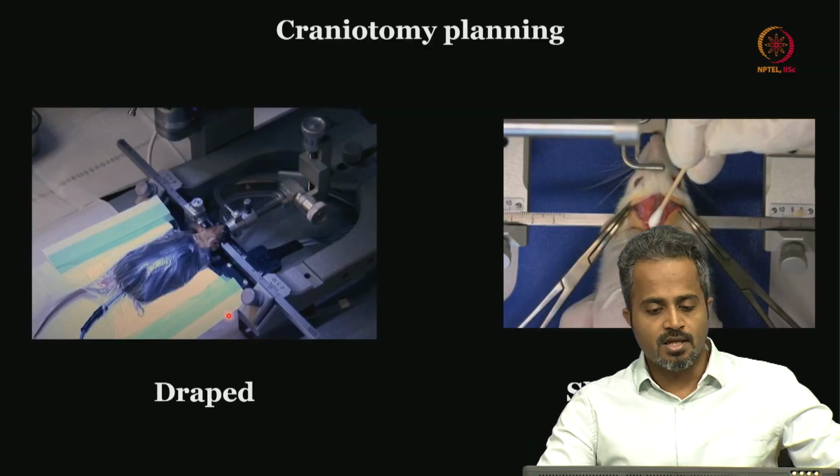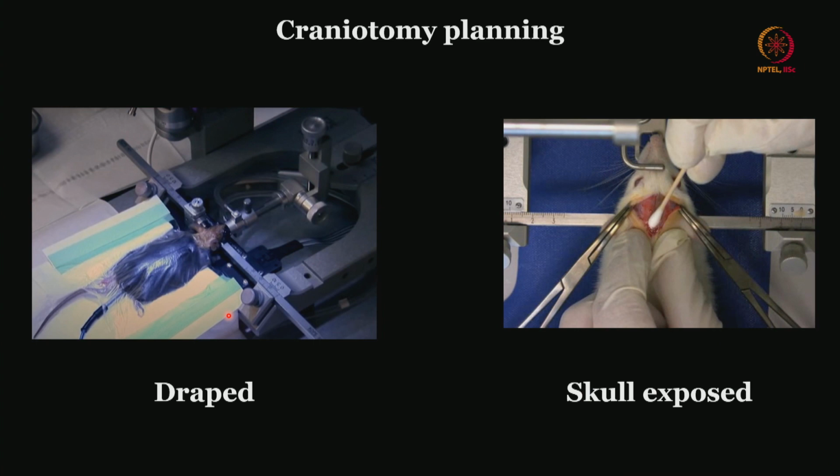Okay, so with that, let's see how it is different from the stereotactic planning. So craniotomy planning, as I said earlier, you are doing a wide exposure of the skull. We can do a limited exposure, but then it doesn't really add much if you are going to limit the length of the incision. So I guess the length of the incision, whether it is for a stereotactic procedure or for a craniotomy, is more or less the same. And the incision limits have already been discussed.